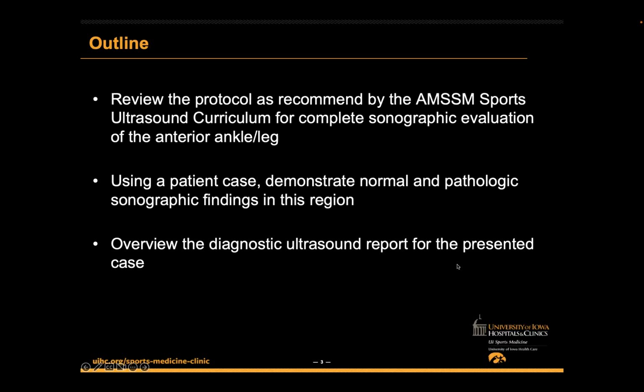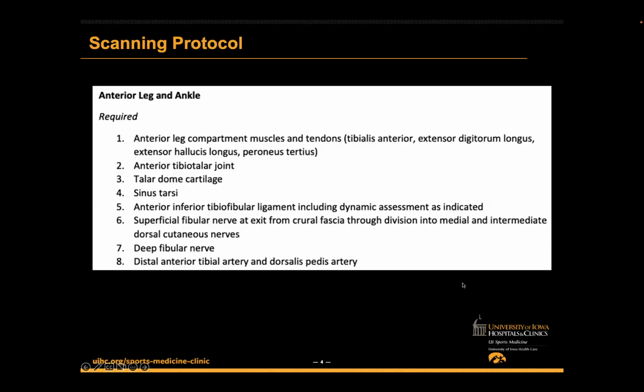Our outline today will review the protocols recommended by the AMSSM Sports Ultrasound curriculum for complete sonographic evaluation of the anterior ankle and leg. Using a patient case, we'll demonstrate normal and pathologic sonographic findings in this region. And then we'll overview the diagnostic ultrasound report for the presented case.